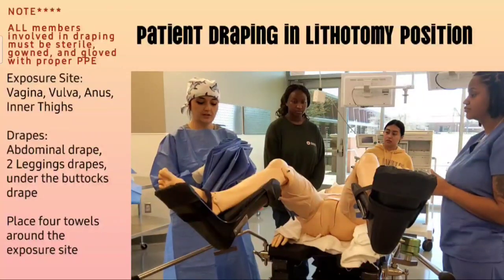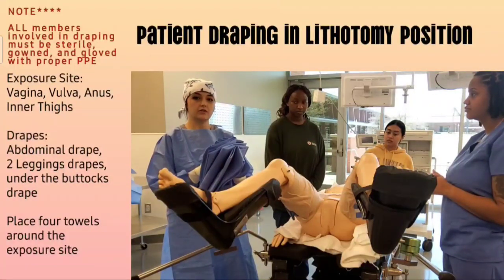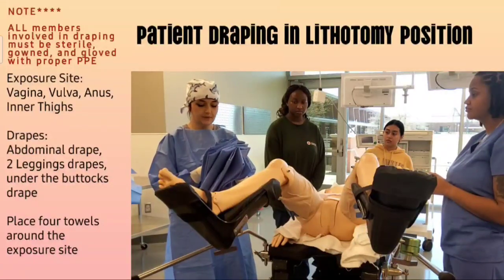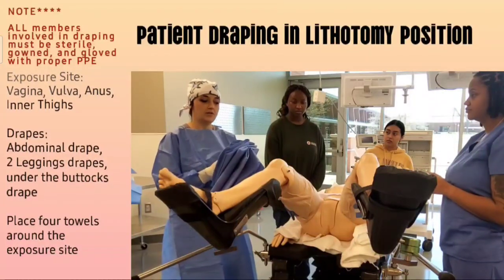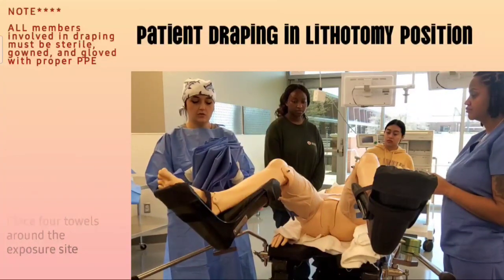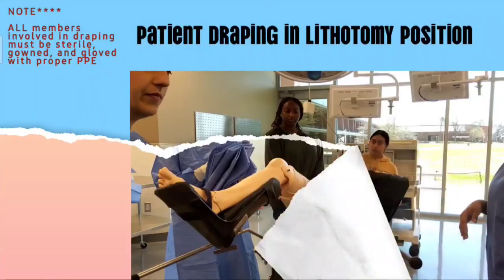You will place the drape under the butt and unfold towards the floor. Make sure that your hands are always cupped whenever you are draping your patient. Use towels to outline your surgical site. For us, that will be the vulva. And one of the towels will be used to isolate the anus to prevent contamination.